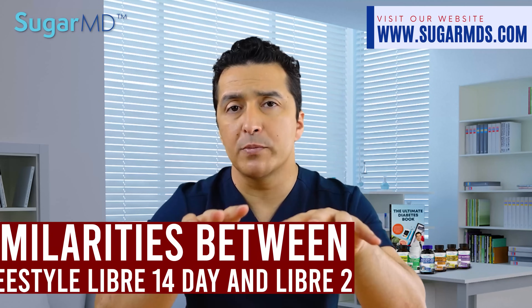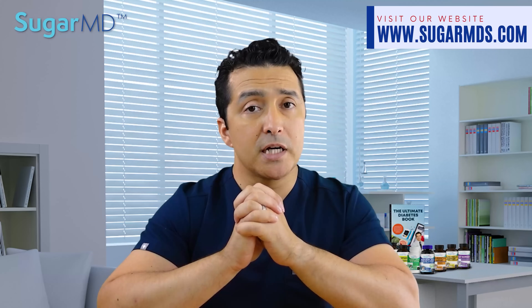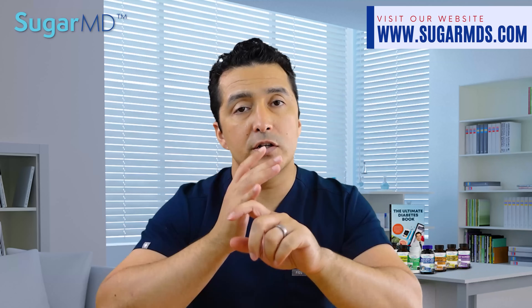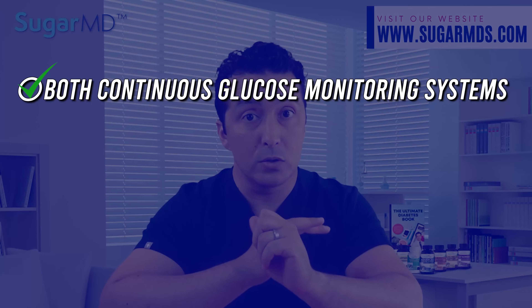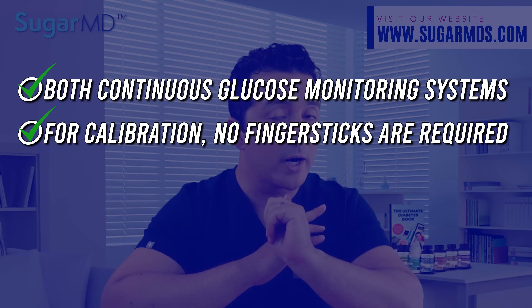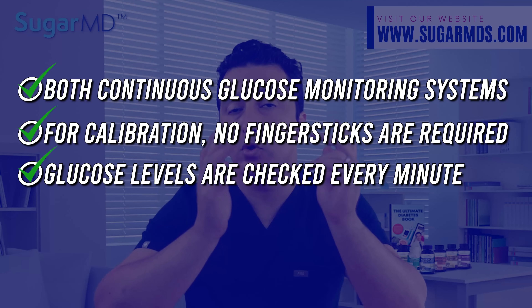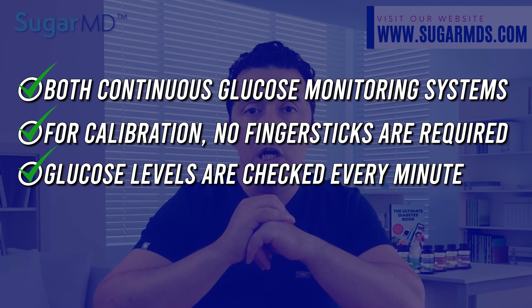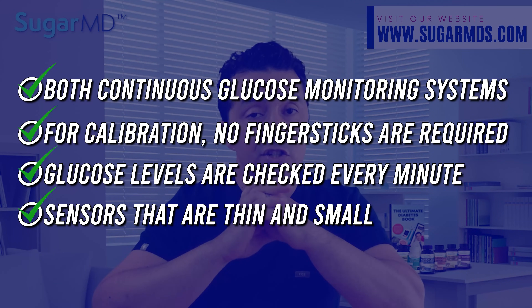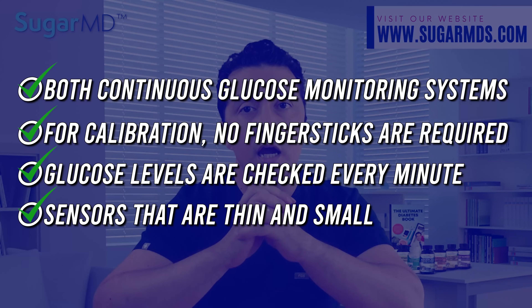Let's talk about the similarities between the FreeStyle Libre 14 Day and FreeStyle Libre 2. They have a lot in common because they are made by the same manufacturer. Both are continuous glucose monitoring systems with no calibration and no finger sticks required in most cases. Glucose levels are checked up to 1440 times every day — that's the most you can get in any CGM.